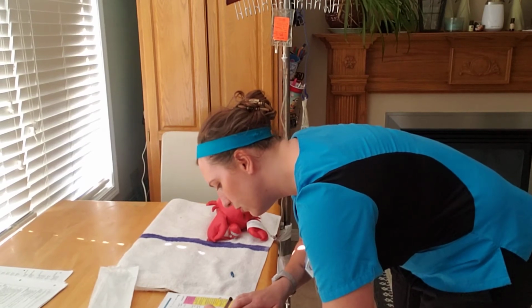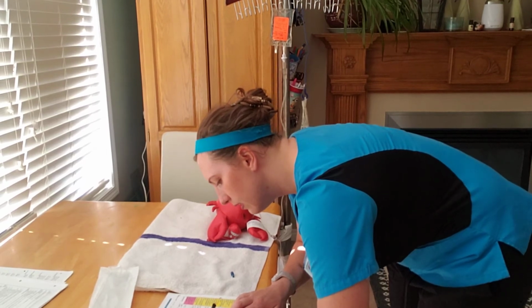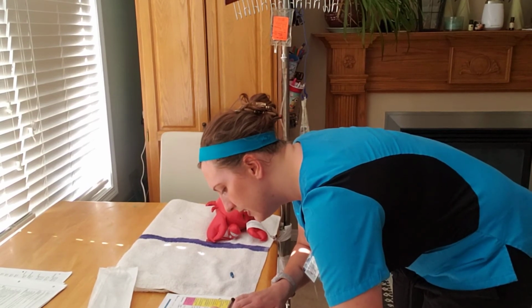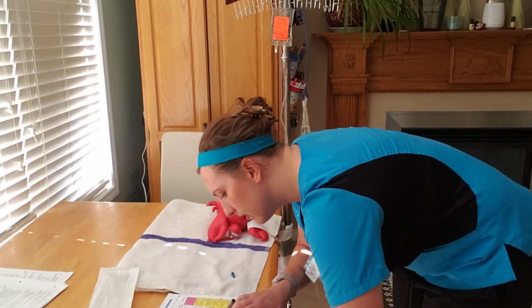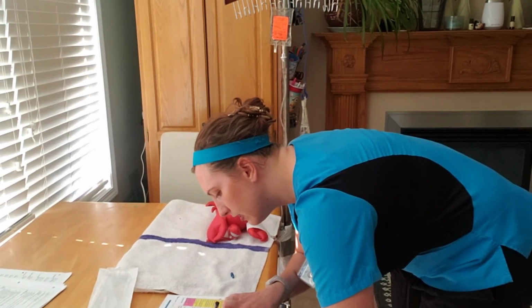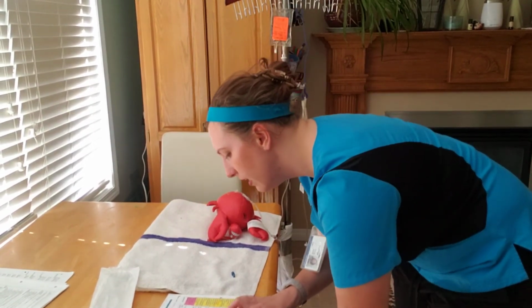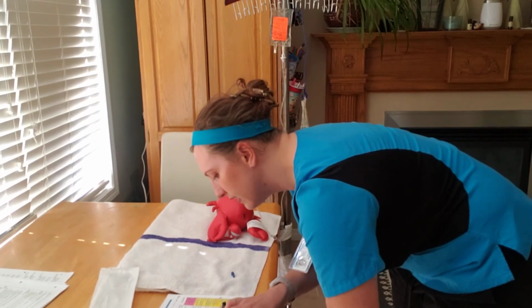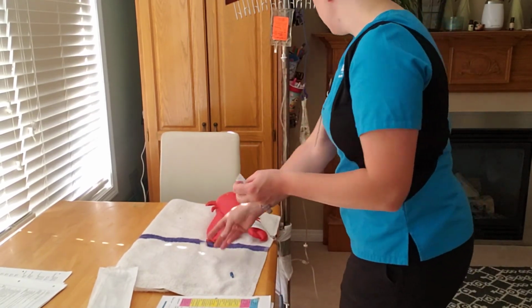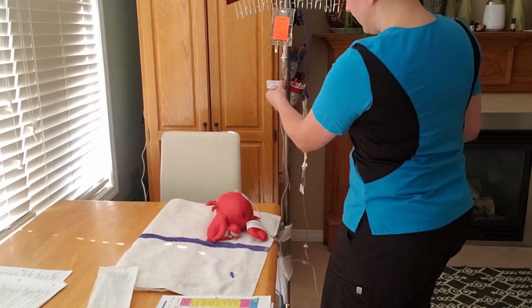So today's date, June 25th at 0700 hours. This is on the secondary line, and this is ranitidine. Ranitidine, 50 milligrams. Okay, and now I'm going to write my rate of infusion here as well. This is going to run at 156 milliliters per hour. Okay, so I'm just going to label this before I forget. Okay, so it's right there, very visible.